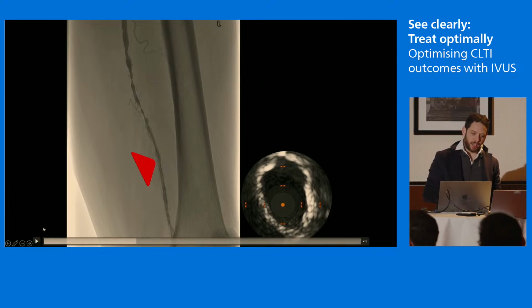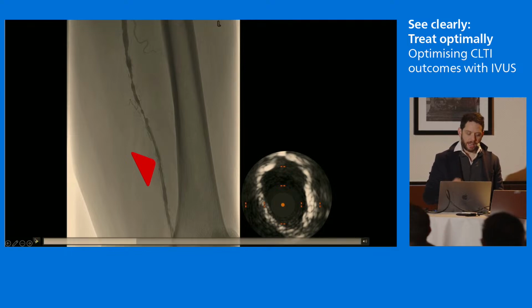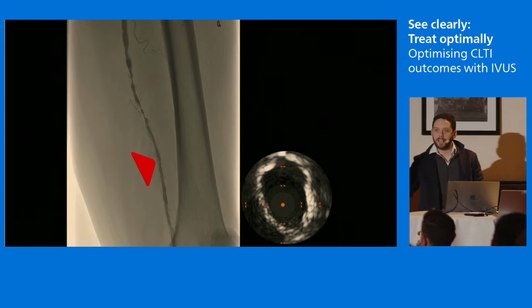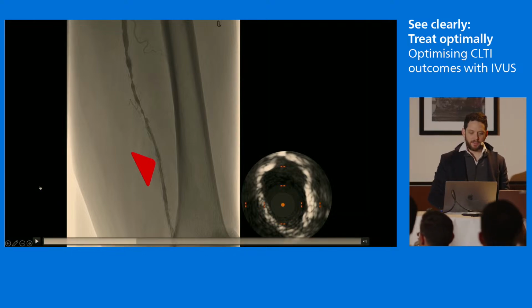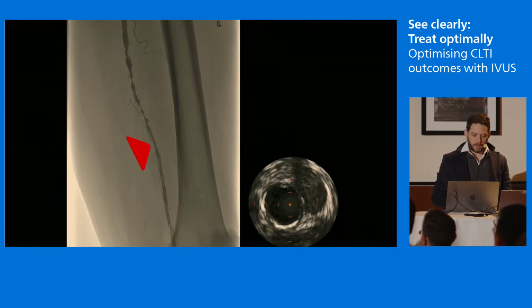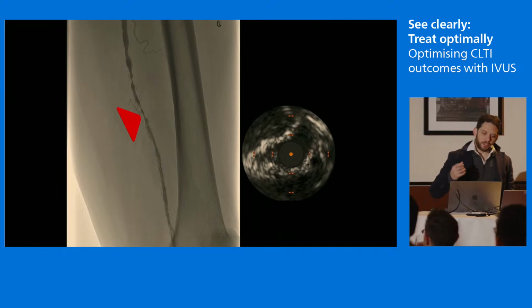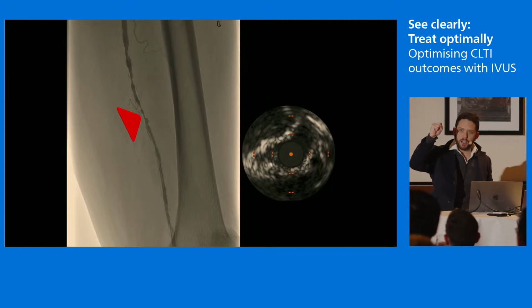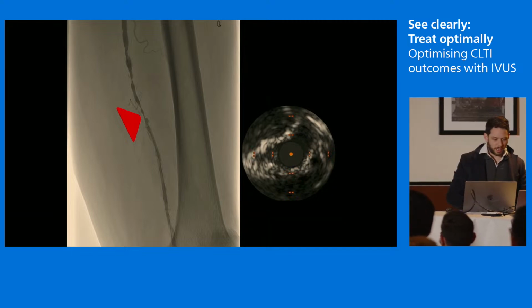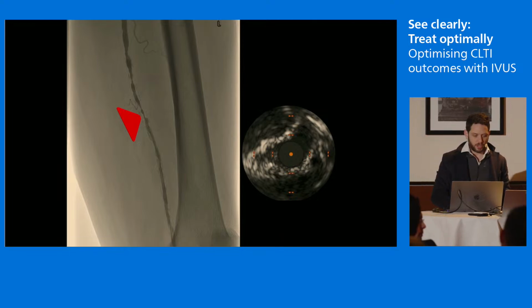Step 1, P1, just after the adductor canal. What are we seeing? Lots of calcification, and as Ash was alluding to earlier, you get that breakdown between the media and the intima. Effectively it becomes one calcified coral reef. I like to call this the bumhole sign. This is where the calcification is almost crimped to the artery closed, also known as coral reef to be less rude. You've got this real tight, almost vice-like calcification here.